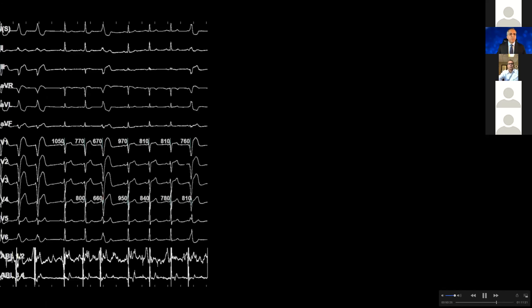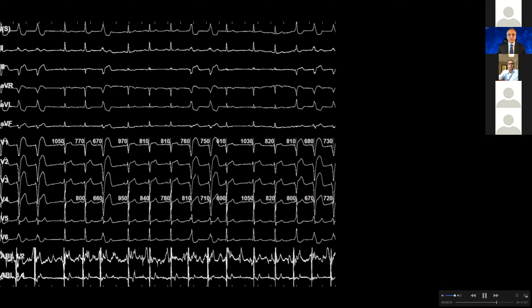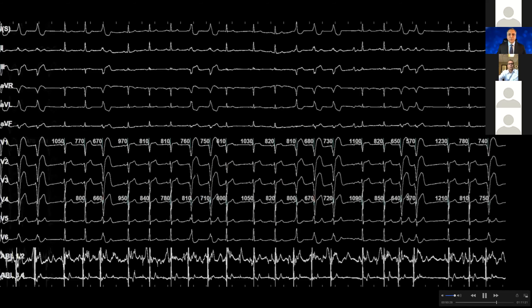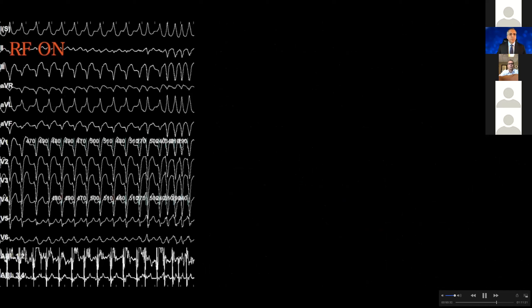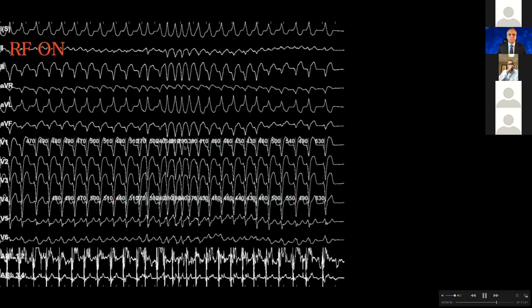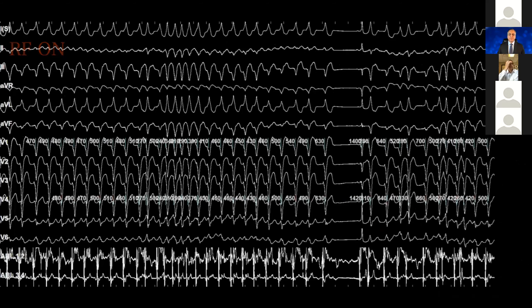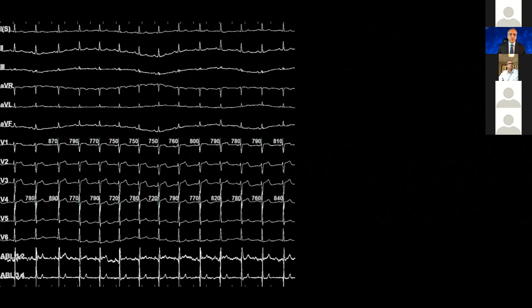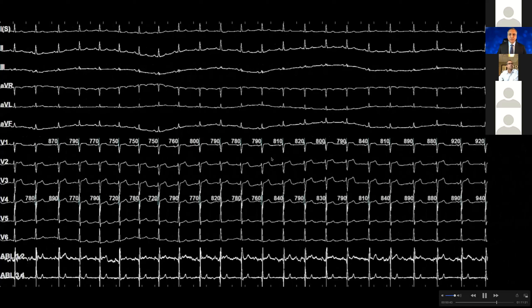Here you can see during the ablation catheter, during the ablation, interestingly, the patient developed a lot of nice PVCs. I've been following this patient for several months and he's doing pretty well, so there's no more PVCs again.